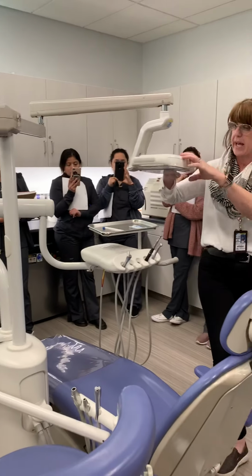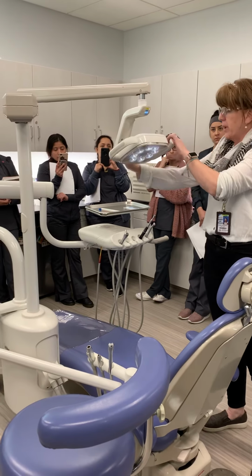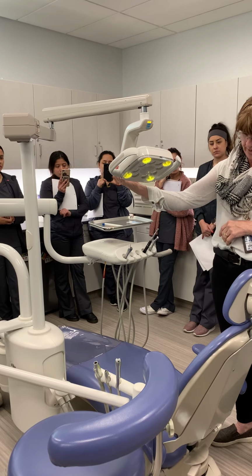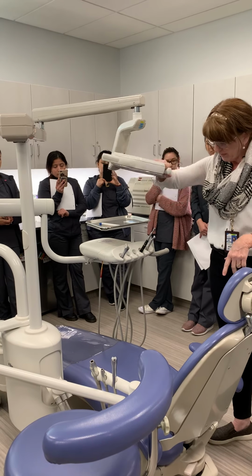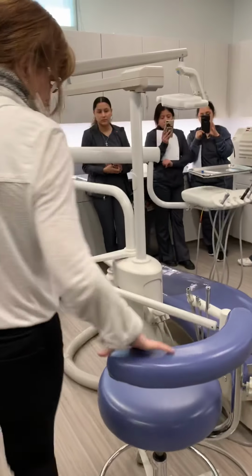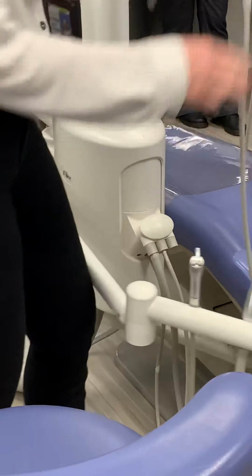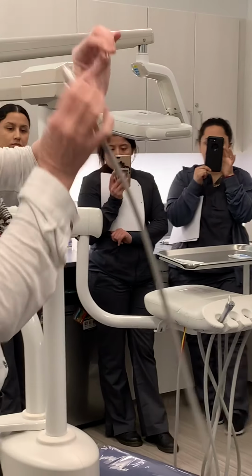This is our overhead light, never headlight, never just light. Overhead light, point it at the chest, turn it off. It has different settings. It has bright, brighter, and green for light sensitive material. Okay, next we have our assistant's instruments or handpieces. We have another three-way air water syringe. We have the saliva ejector and the saliva ejector tip and hose.